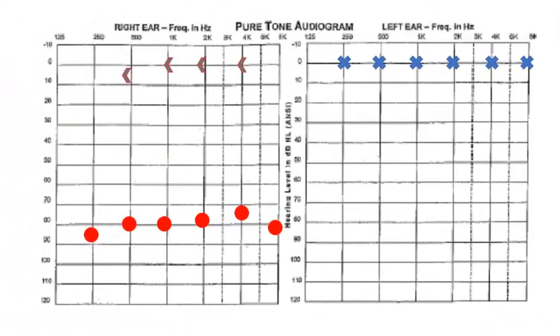Here is a severe hearing loss in the right ear with unmasked air and bone thresholds being shown on the right side. We know the min-IA values, and this situation does exceed those at all frequencies. If we know that the person did not have the typical min-IA values, well, what can we say about the interaural attenuation here? At 1000 Hz, we have an 80 dB air-bone gap. We can't say for sure that this unmasked air conduction threshold is accurate because the value exceeds what we know the minimum attenuation to be.